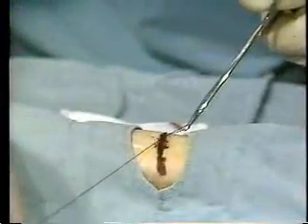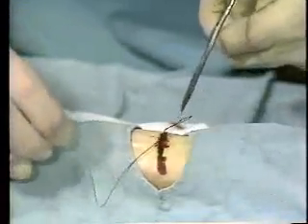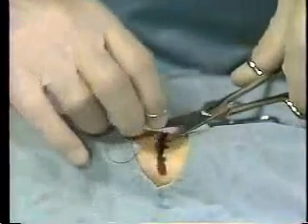Remember, always pull the needle end in the opposite direction of the side where the short end of the suture emerges from the skin. The short end is pulled in the opposite direction. Finally, cut off the suture close to the knot. The first suture is now complete.